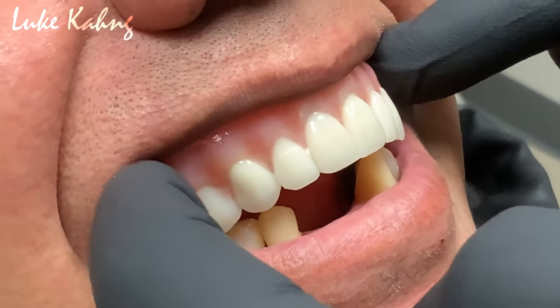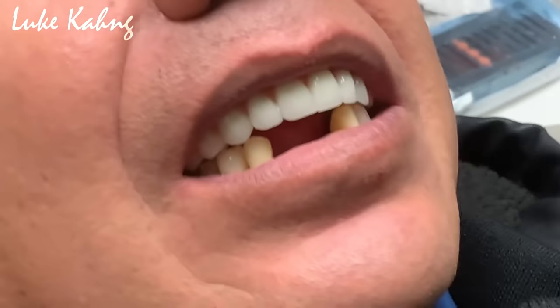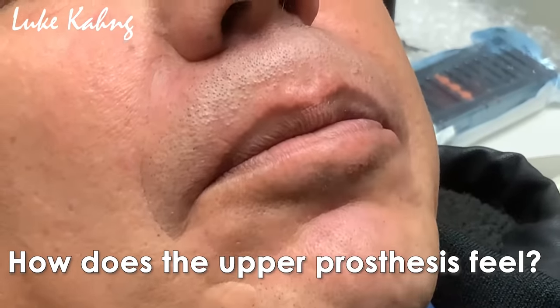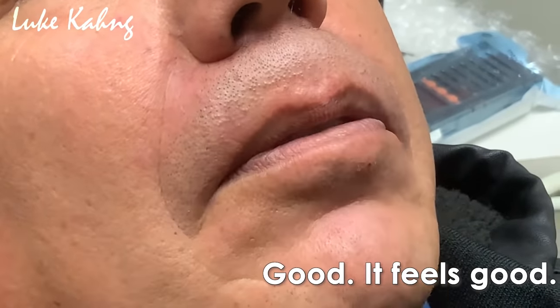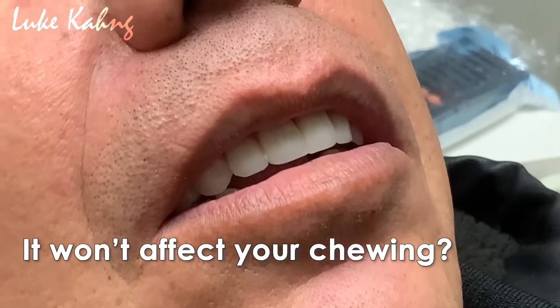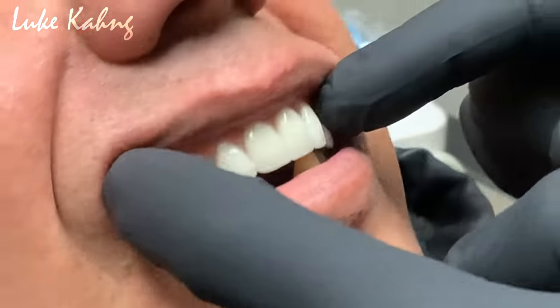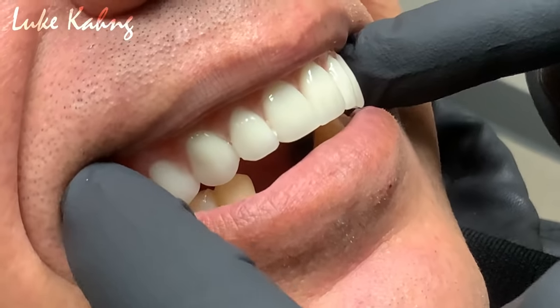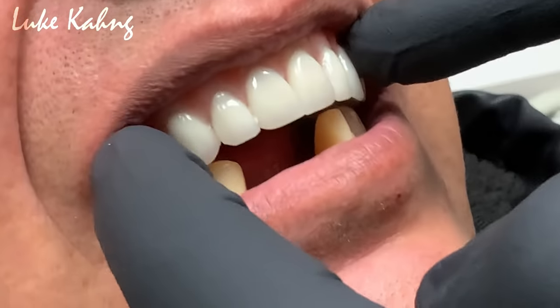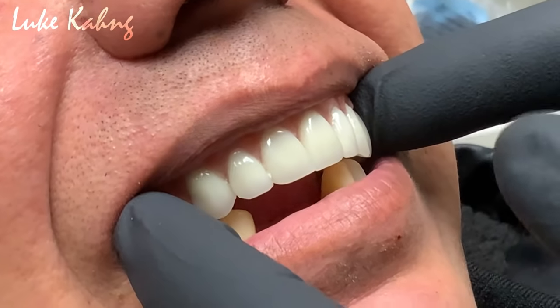Look at that. Looks good. Beautiful, right? Here, let me ask him in Spanish. You recording this? ¿Cómo siente el prosthesis de arriba? Bien, ahorita bien. ¿Lo siente bien? Mm-hmm. Bien, bien. Sí puede masticar bien, no le afecta al masticar. Ahorita no, está bien. No me lastima. So I'm asking him in Spanish how does he feel as far as when he bites down on those two teeth. We're gonna try the lower flexi in just one second, but I always start with the top with the complete, and then you move on to the lower one.